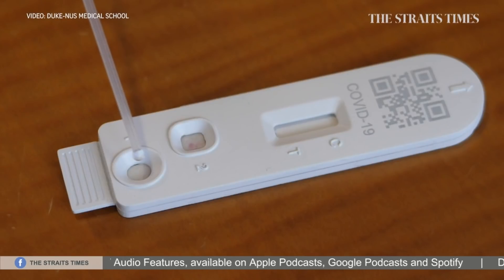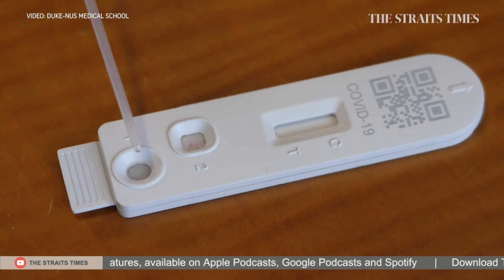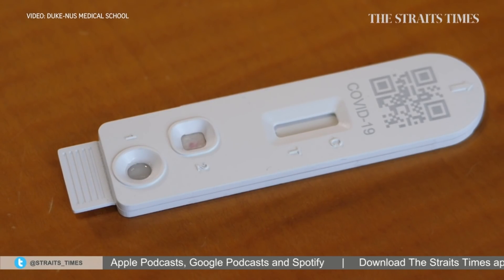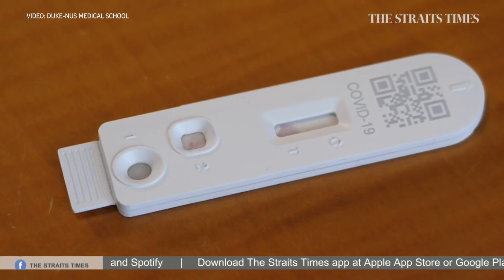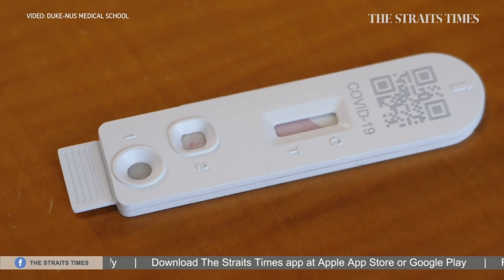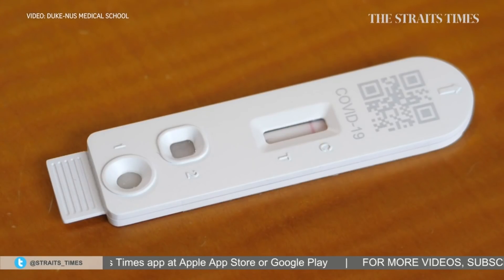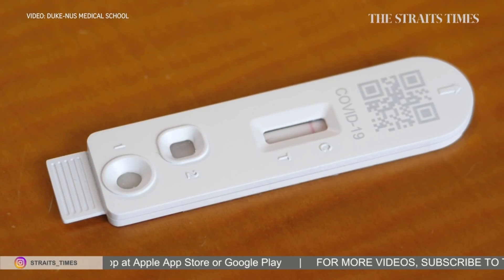In channel number one, it works exactly like a normal test kit where the virus binds to red-coloured gold nanoparticles. This colours the virus and it travels up to the membrane — the reporting window — where if there are two lines, it means the virus is detected, and if there's only one line at the C region, it means there's no virus detected.